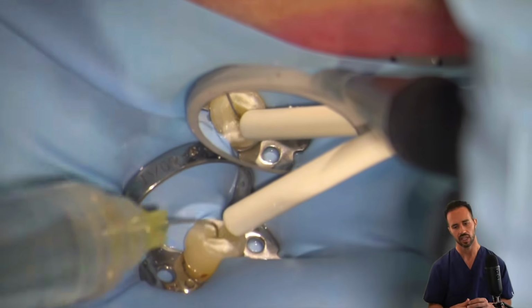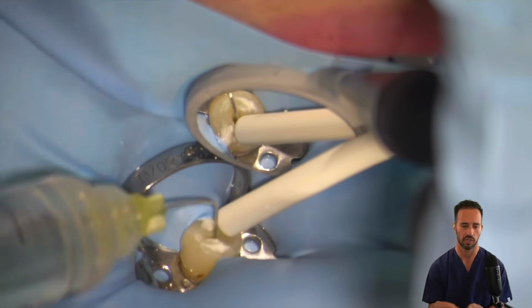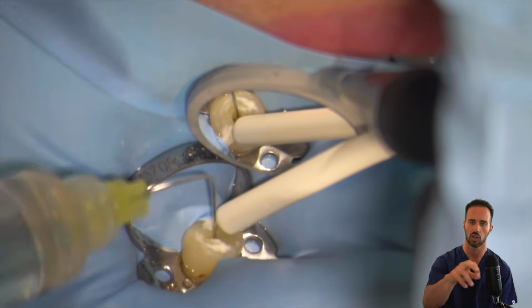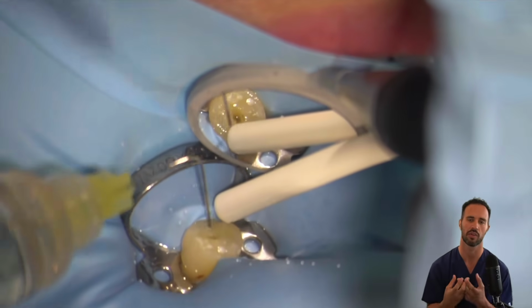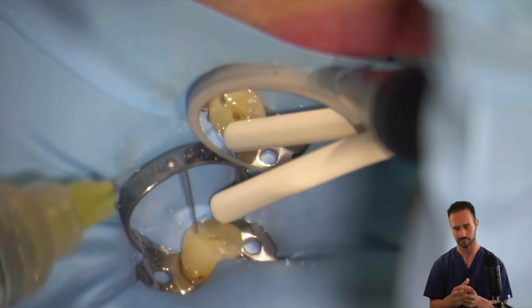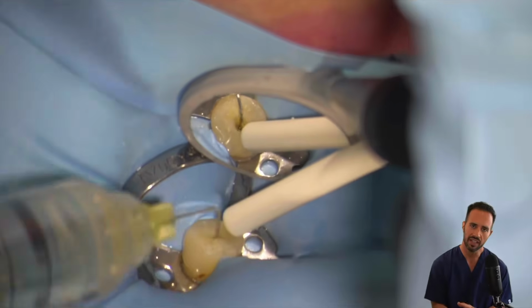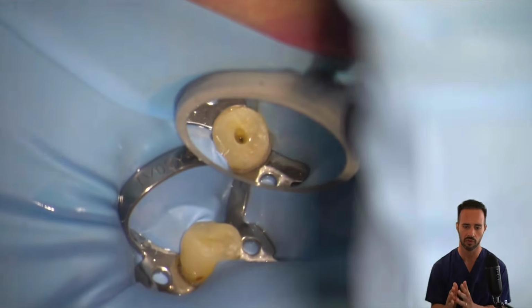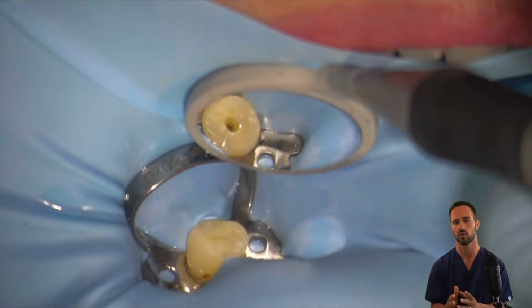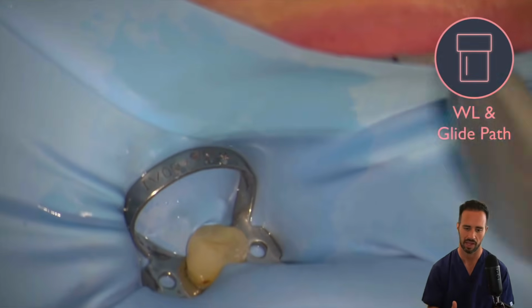Okay, and if you get some debris, don't be shy about putting some hypochlorite along the surface of the tooth just to dissolve that debris and make sure we're working with a nice clean area. Okay, so now that we can see that we're in the canal, we have a nice initial shape in the coronal third of the root. Then we're going to proceed to our working length determination and our glide path preparation.